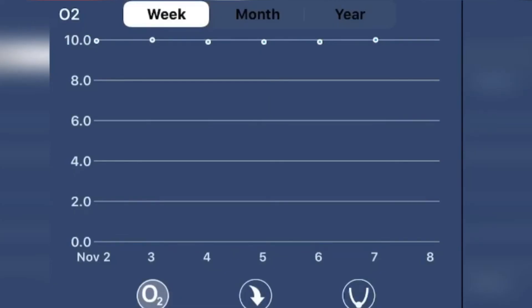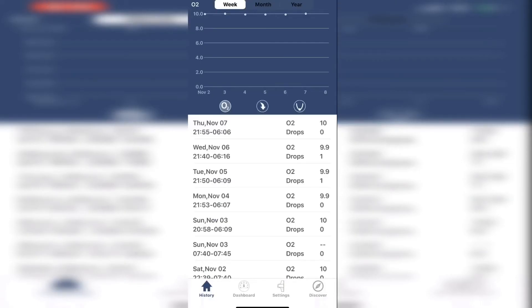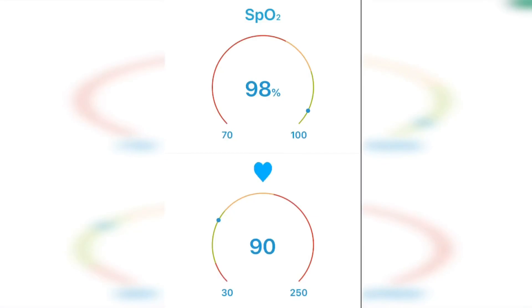View all of your records from week to month to year. While wearing the ring and in the vHealth app, tap dashboard and you can see current oxygen percentage and current heart rate on a scale from bad to good.